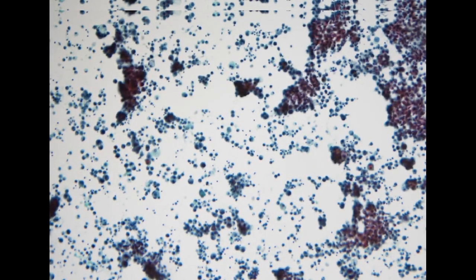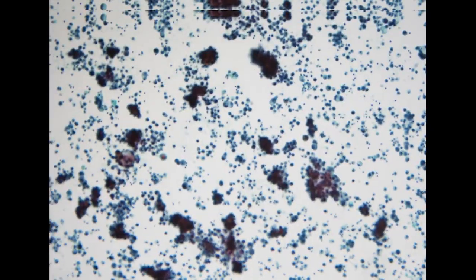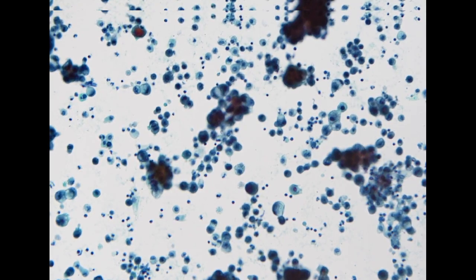So the next specimen is coming from a 69-year-old female, and this is a pericardial effusion. For a pericardial effusion specimen, the positive rate is actually really high because of the location. If you have nothing wrong, you won't go there, right? Unlike, for example, a urine specimen, where the positive rate is really low, for pericardial effusion the positive rate is really high. And about 70 to 80% of the time, we will see metastatic lung adenocarcinoma.